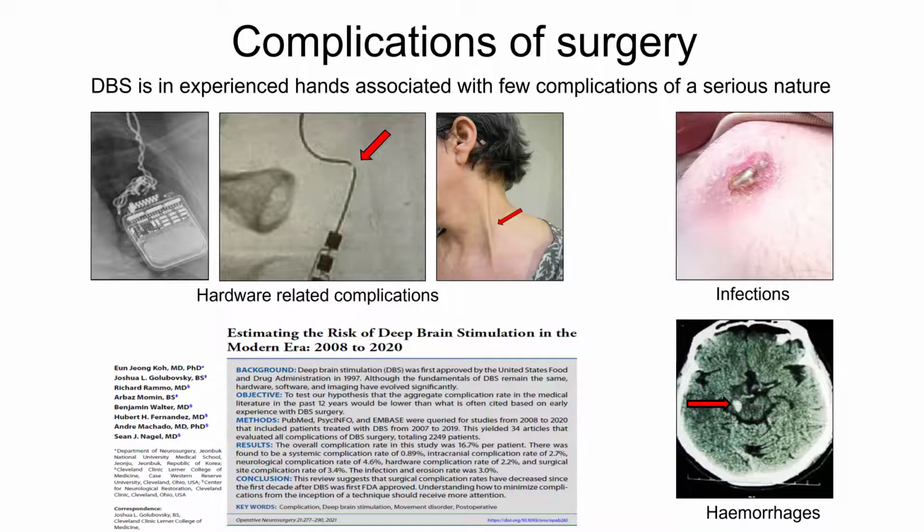Complications from the implants themselves, such as cable breakage, straining cables, and malfunctioning, occurs in about 2% according to the literature. Such side effects will not be life-threatening, but often minor surgery is required to correct them. I am personally more afraid of infections. These can occur within days after surgery, when you change the battery, or at any time due to unknown causes. They are seldom very dramatic.